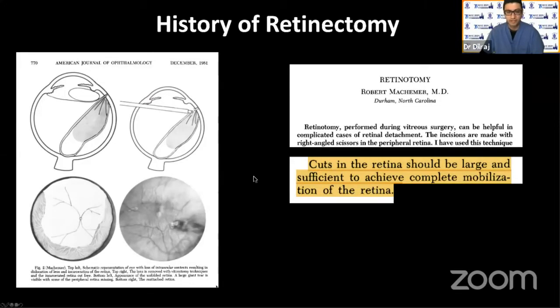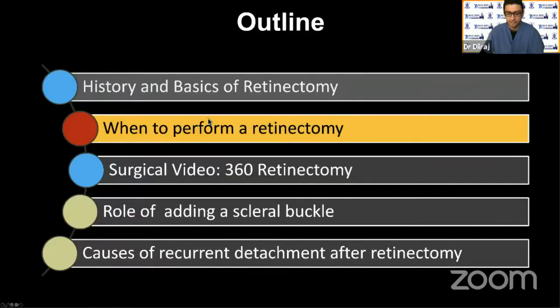I'm sure as many in the audience are aware that retinotomy or a relaxing retinectomy has been around for almost 40 years and was originally described by Bob Machemer as a way to achieve complete mobilization of the retina, initially in cases of incarceration following trauma.